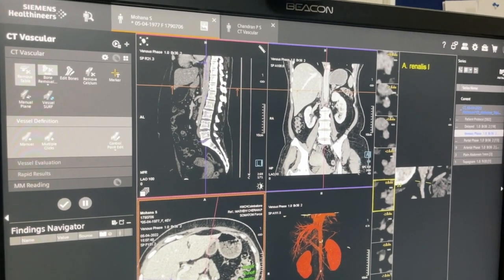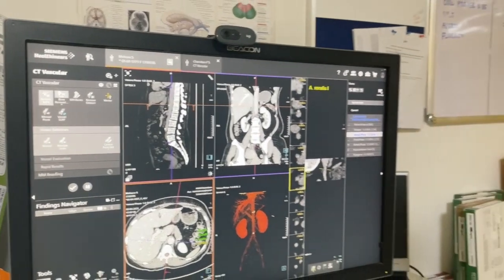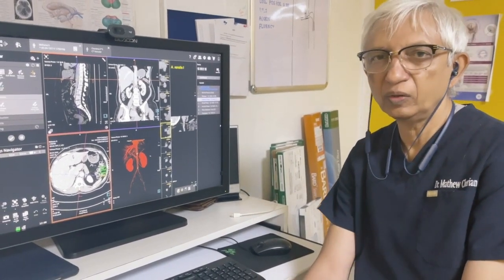So we now have all the answers: the left adrenal vein arises from the left renal at 1.7 centimeters — use a Sim 1 or exchange to a Bernstein as Dr. Santosh does. On the right, the target is superior and posterior at the lower end of D12. To obtain a sample you need three simultaneous samples, so you need access from both groins, or two punctures from the same side — one catheter in the left adrenal vein and one in the right.